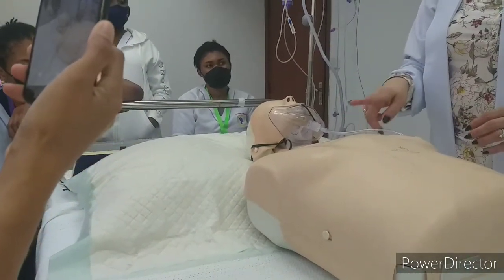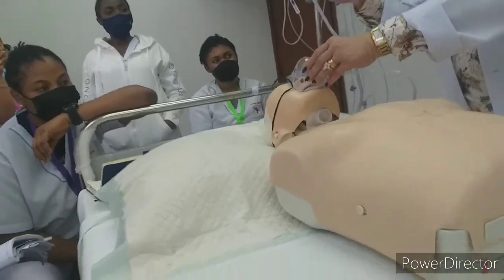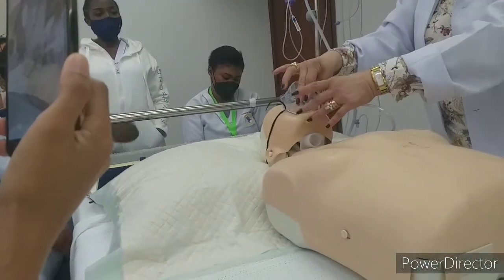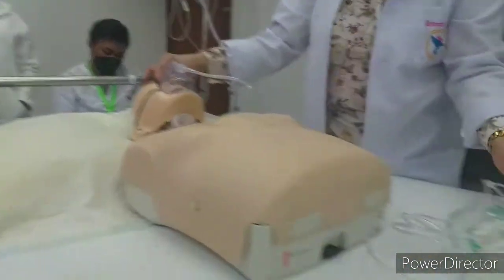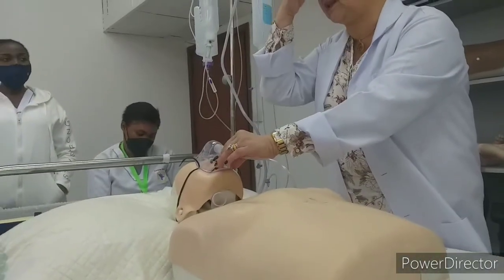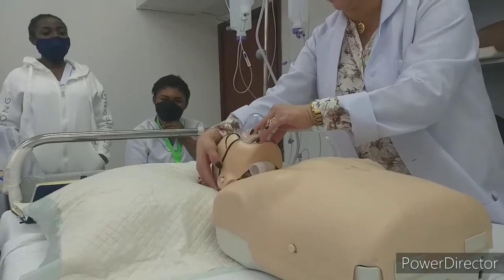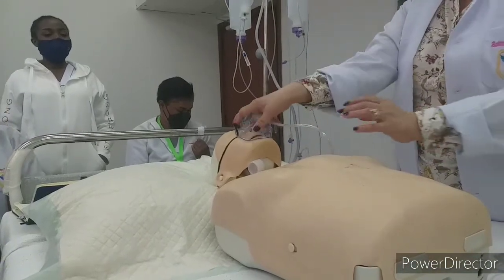Now, if the patient doesn't have tracheostomy, we will put it to the face. This is the most common, the normal thing. So you must see to it that down of this mask is hugging the chin. Okay? And this upper part, there must be something like a metal part, like this. Okay? So metal part should hold the nasal bone, to prevent the oxygen from leaking. So same thing, over the ear, adjust, and keep for the patient. Okay.